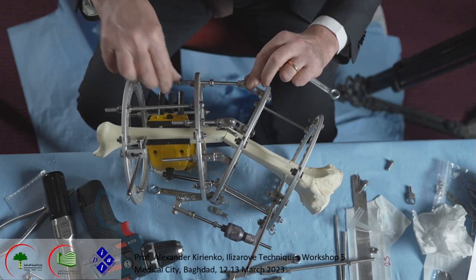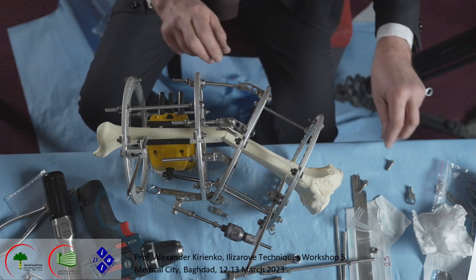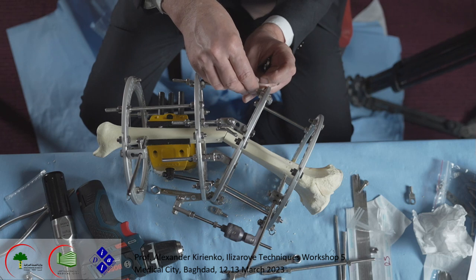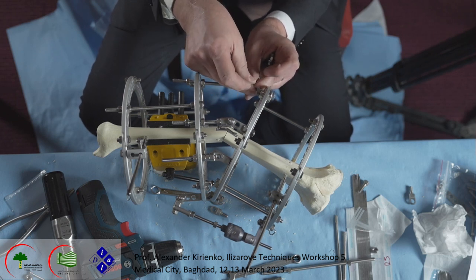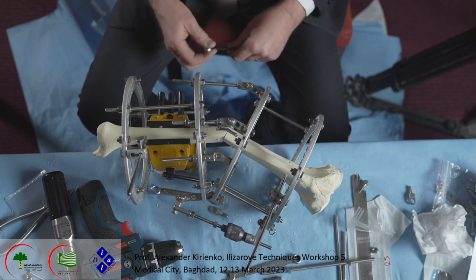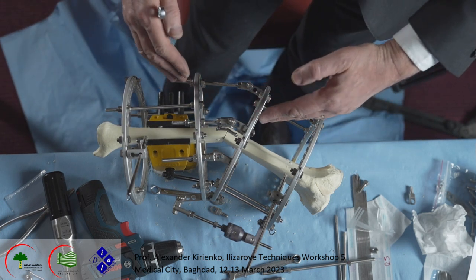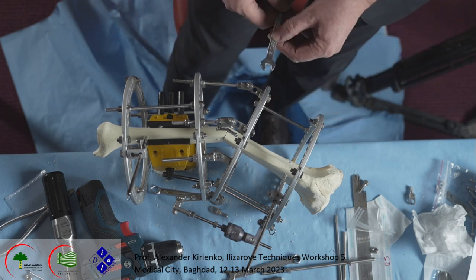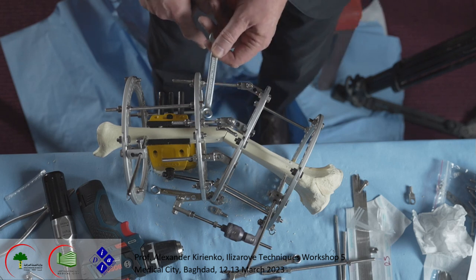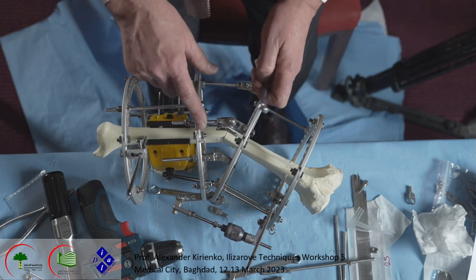And again, I should notice, you see, if I put this rod like this, geometrically calculated, what happens here is that this rod is not perpendicular to the ring here. And like you see, it is a little bit inclined, because if the two rods have this big inclination, the distance between these two systems and these two rods is different because of the inclination of the rings.